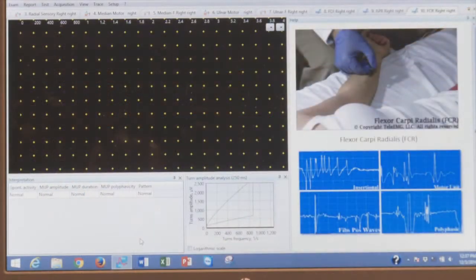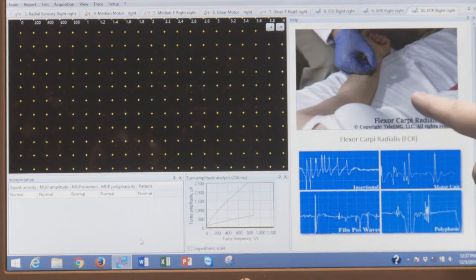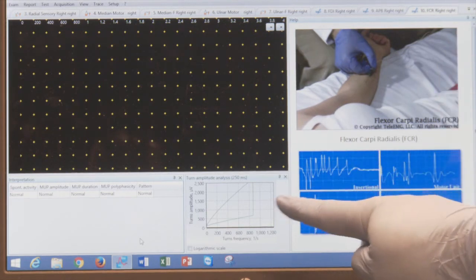When we're looking at the flexor carpi radialis, the picture here on the screen shows you where we insert the needle and also shows you the cloud and what the potentials should look like.